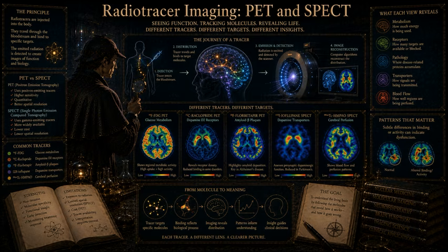So we do a baseline scan, then 2 days of AMPT depletion, then a second scan. Because we have removed the resting dopamine that was secretly occupying some of the receptors, our radiotracer now has more VIP spots available to bind to. The BPND goes up. You unmask the receptors that were occupied by the baseline traffic.